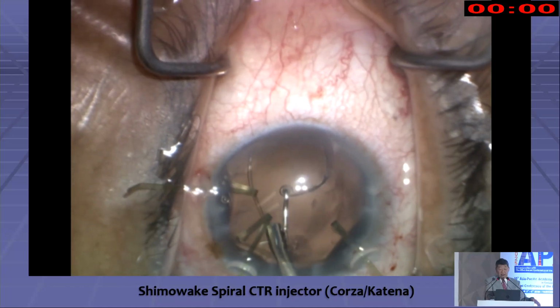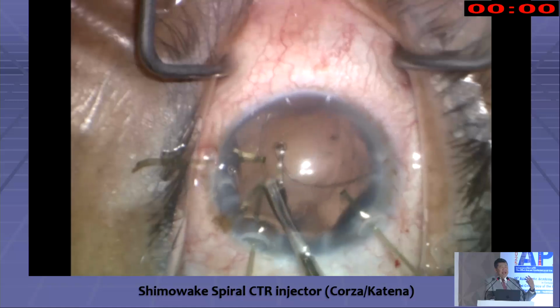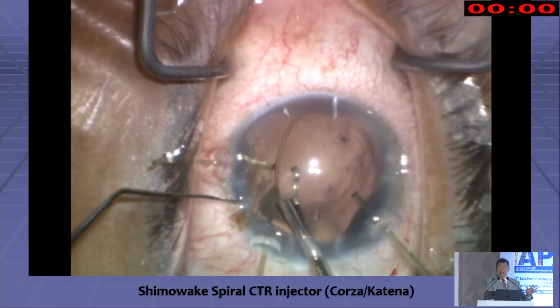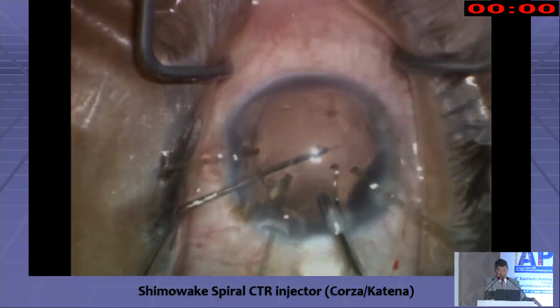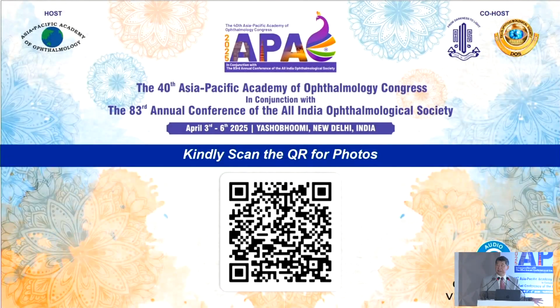You run into these other areas sometimes where the bag has a fold. You avoid all those troublesome areas by the lead eyelet not having to go there. So you can purchase it and put your name on and order it, but it's not actually yet available in India. And in the United States, it only became available in December, January for orders.